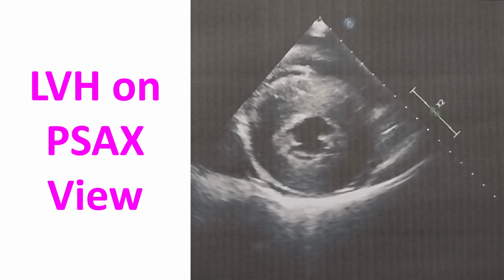And while taking measurements of the left ventricular thickness to risk stratify hypertrophic cardiomyopathy, we have to take multiple sections. This is a section at one level. We can take distal sections and proximal sections and other views also, and take the septal thickness where it is maximum. That is how it is useful in risk stratification of hypertrophic cardiomyopathy. When it is done for other causes of concentric left ventricular hypertrophy, that may not be so important.